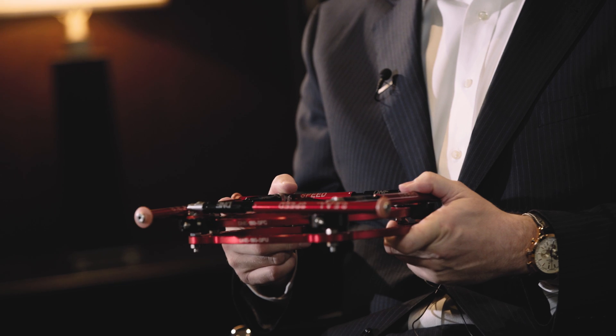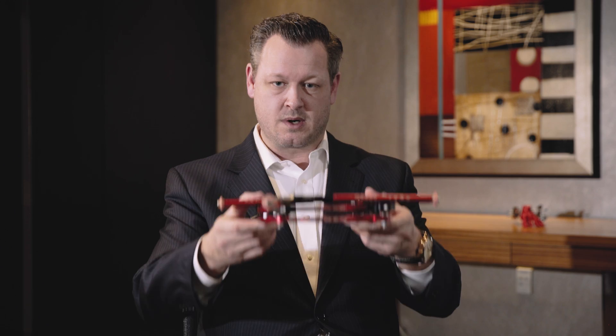The Seal Frame is a very unique external fixation device — unique to the entire industry — in that it is utilized for a multitude of different pathologies. Another unique modality about the frame is that the frame literally will come to you.